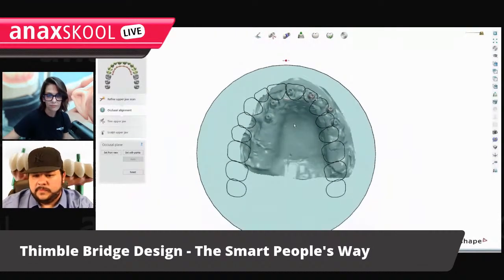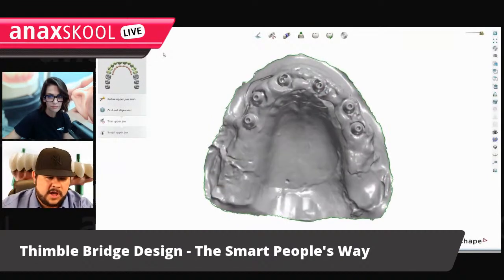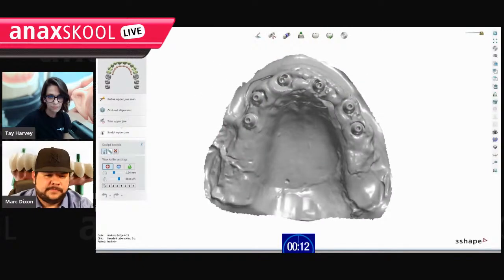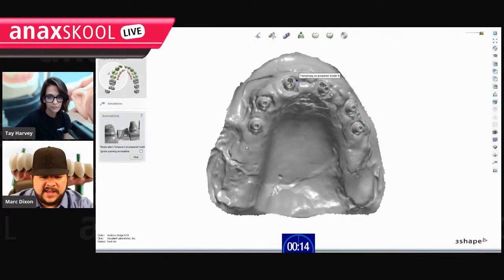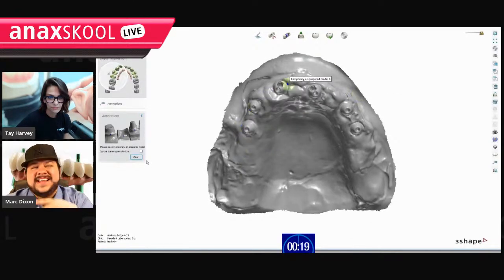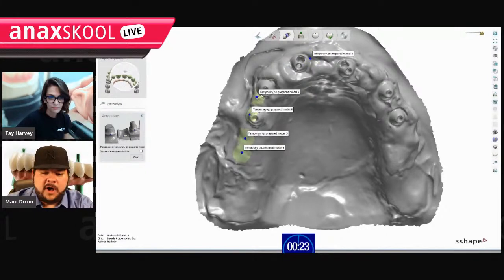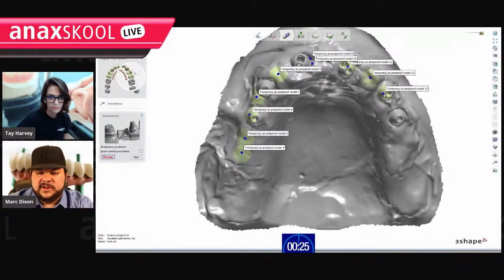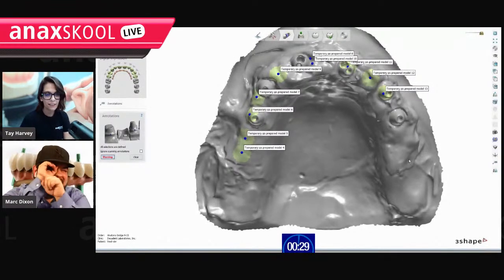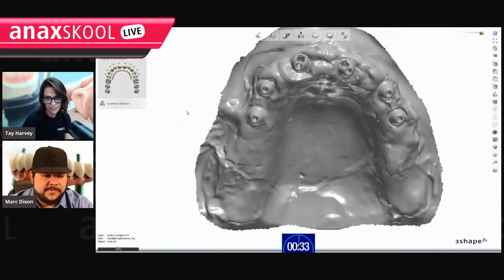All right. How long is it going to take? Step 1. Done. You want to trim it? Trim it. You don't want to trim it? Don't trim it. Done. Annotations. 1, 2, blah, blah. I'm not going to screw around. These actually do matter. They don't for me, but they do matter. If you put them all in horrible places and you don't at least spread them out a little bit, your whole library is going to come in really tiny because it thinks each annotation is like that. So you do kind of have to take a little care of them. It doesn't have to be perfect.